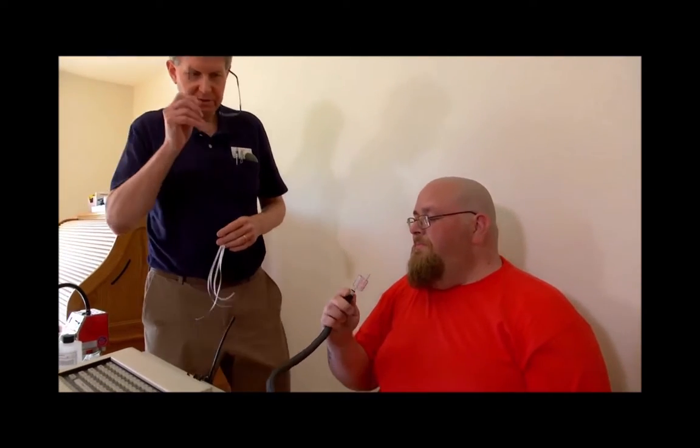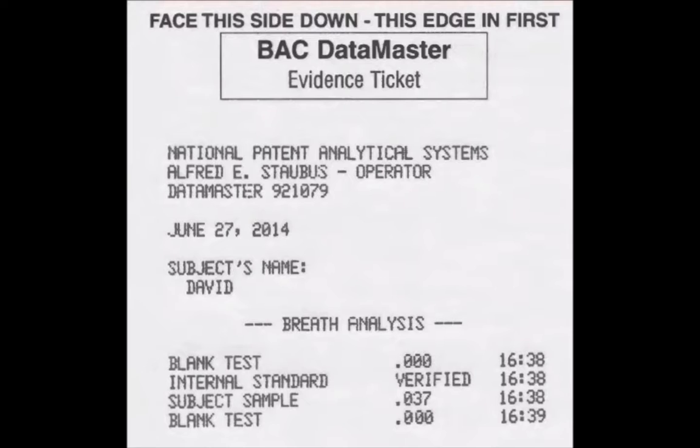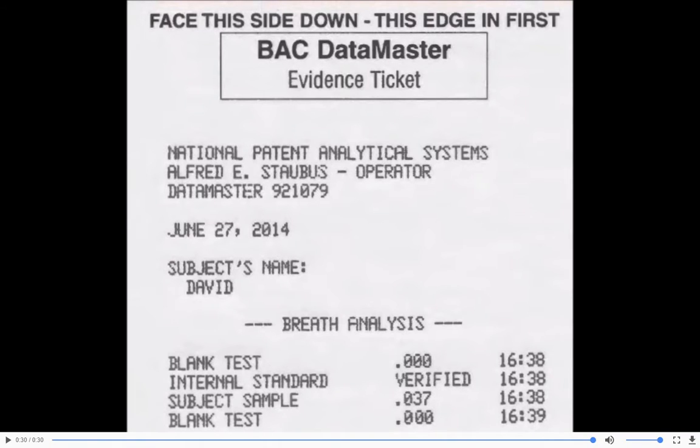Okay, David, again, we want you to not make a tight seal around the mouthpiece. I'm going to hold up a little bit of ribbon that will hopefully demonstrate that there's airflow. Alright, I think that one was more for fun than anything, but Cleve made a good cameo appearance in that one. He didn't get a good seal, but there's still enough airflow flowing through the machine to produce the 037.